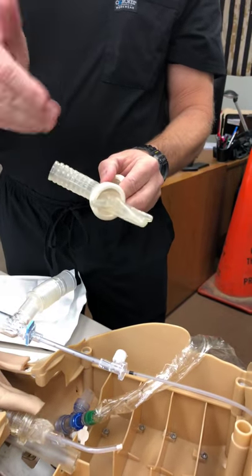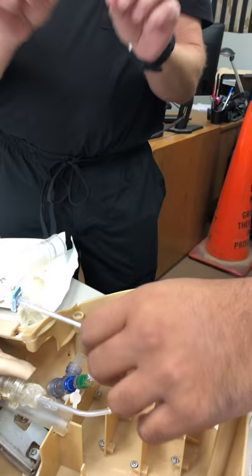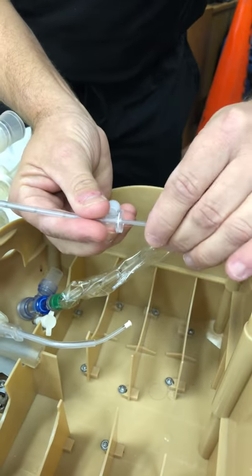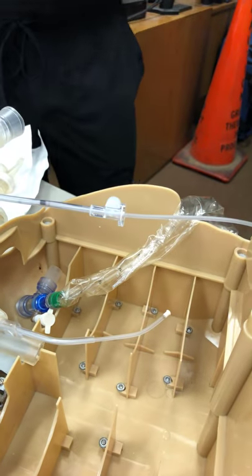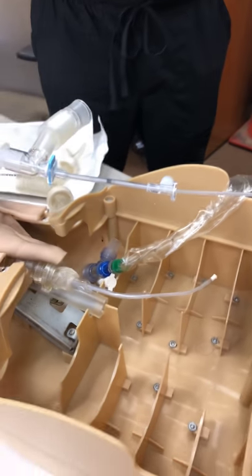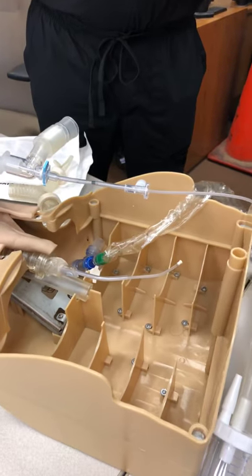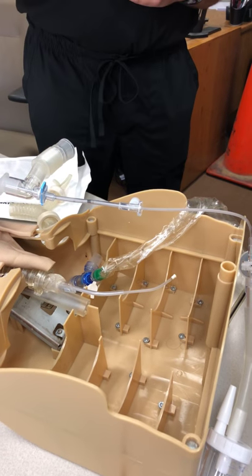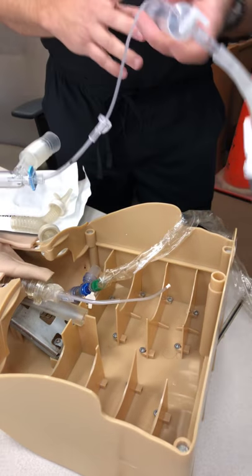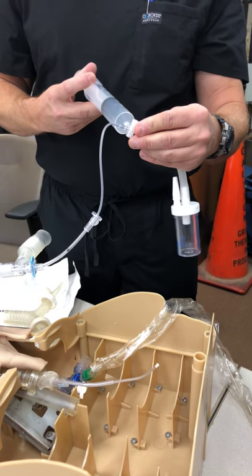Once I get it three to six centimeters past the carina, the next thing I'm going to want to do is go ahead and advance the inner catheter. I would hold it here, and then go ahead and start advancing that inner catheter. The only thing we want to do with that is advance it to the point that it meets resistance. Once we meet resistance, that's the benefit of that mushroom tip — it's not going to create any injury. The next thing I'm going to want to do is give it 20 cc's.